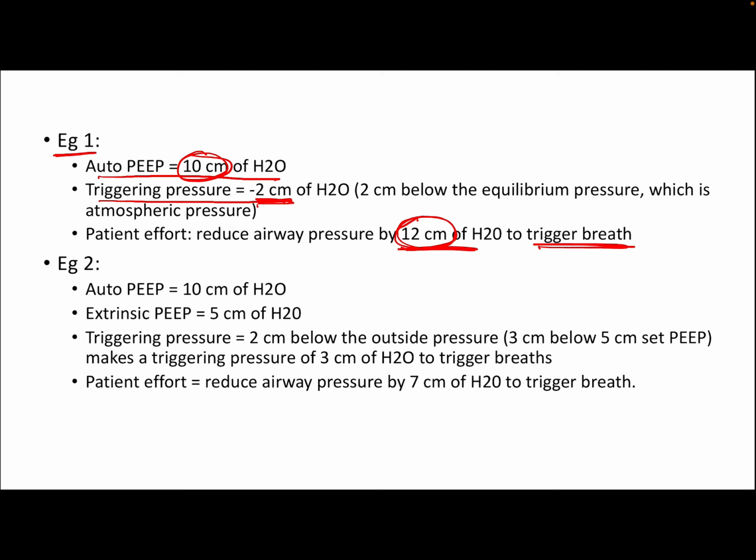In contrast, same patient with an auto PEEP of 10 centimeters, we are applying an extrinsic PEEP of 5 centimeters of water. What does this mean?